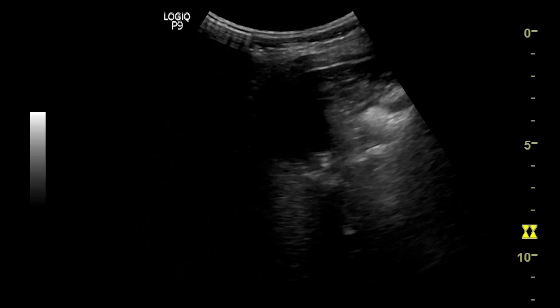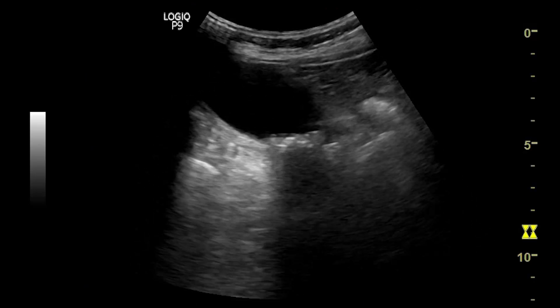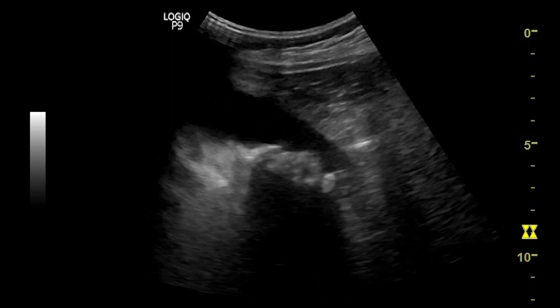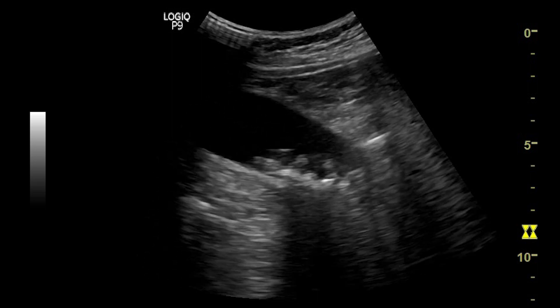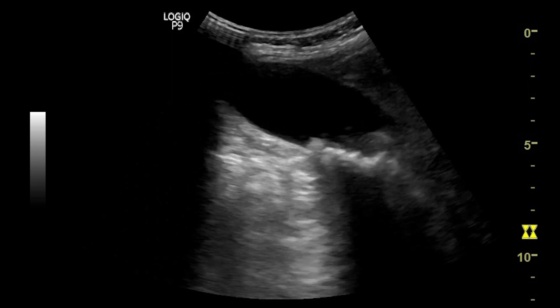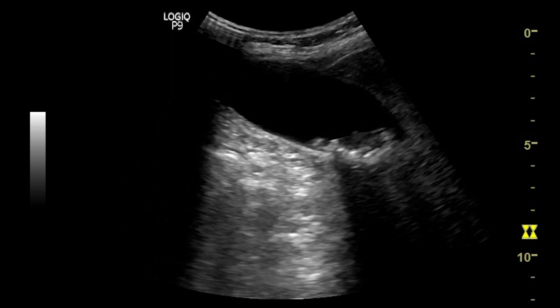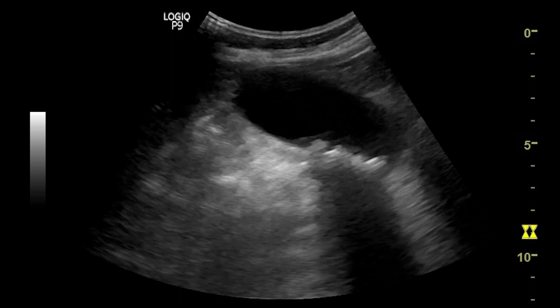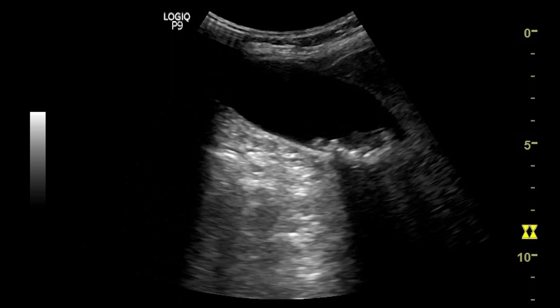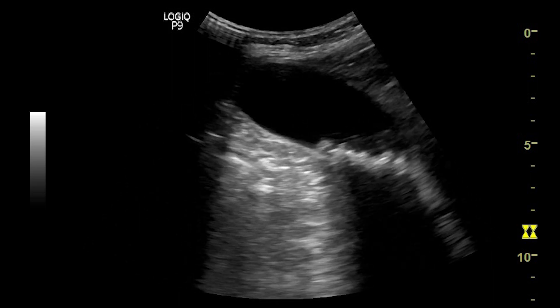On real time, you can see the gallbladder lumen is not distended and wall thickness appears normal. Multiple hyperechogenic structures casting acoustic shadows are noted at the neck and body of the gallbladder.